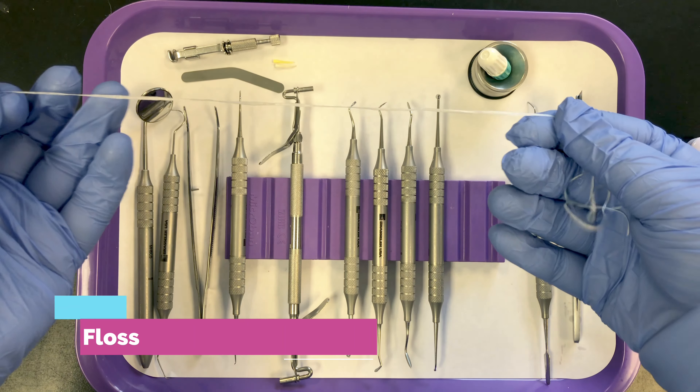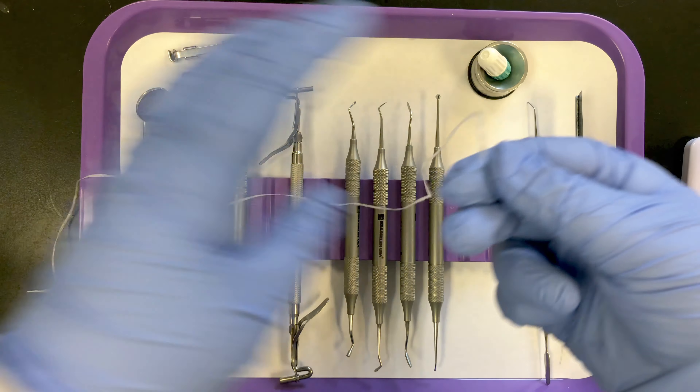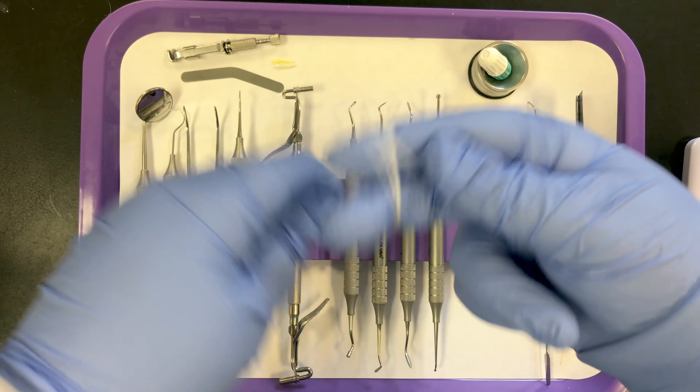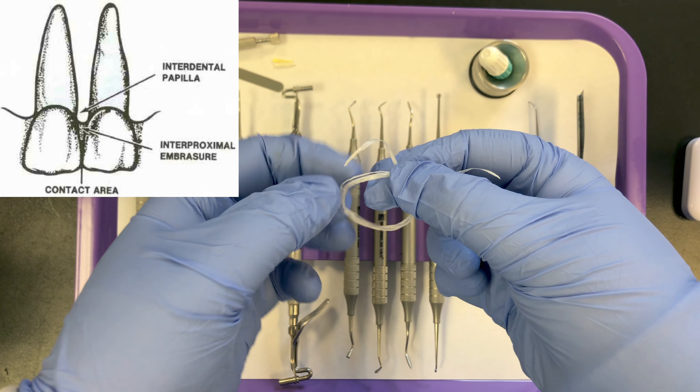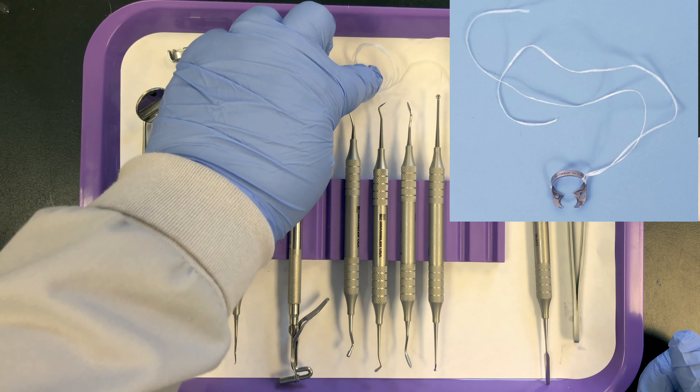Floss — we place this on the tray. We always keep a floss dispenser in the room anyway, but the purpose of floss is to check the contact areas. It can also be used to ligate small objects.